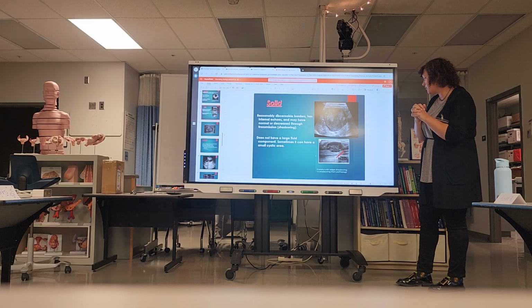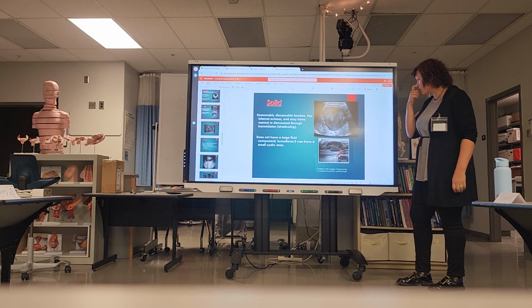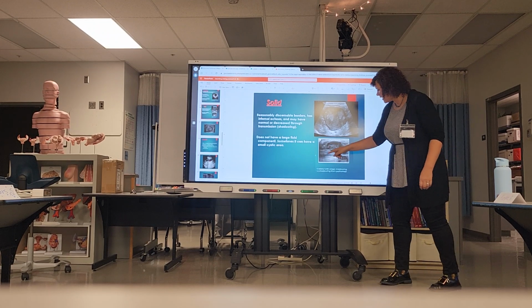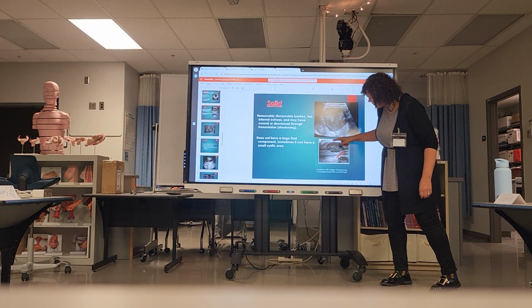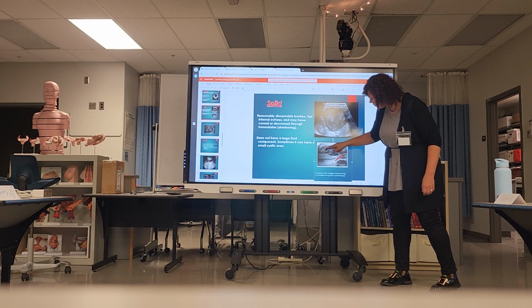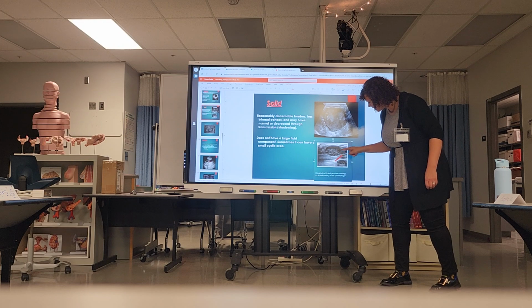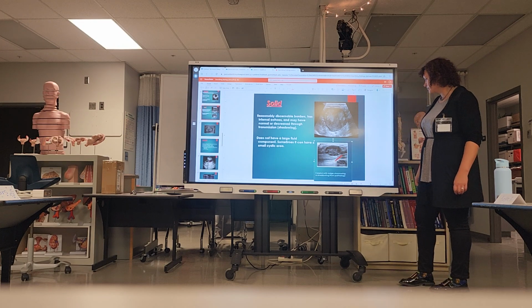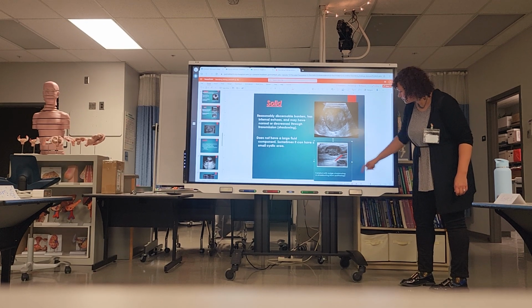And then you guys will learn more about edge shadowing in physics. So round structures can have this edge shadowing, so as the beam is coming around the border here on the sides, it can create shadowing. So don't let that fool you into thinking that there's pathology just because there's shadowing on the edges. Okay, so we see it here, this edge shadowing over here.